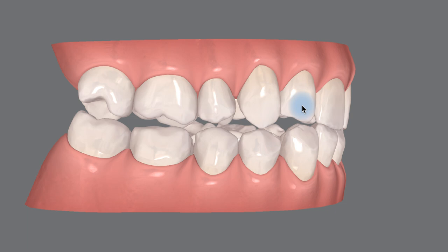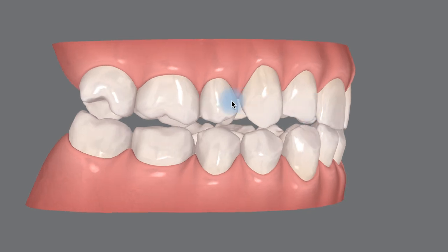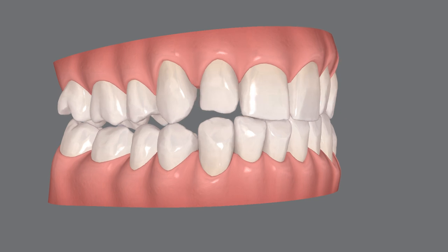And I think you had said that was less than favorable, or you made a comment to some extent on that not being the ideal outcome. And that's neither here nor there. That's historical. All we're going to do here is try to present you with an option moving forward. Because you're missing that, and I don't necessarily think you had the skeletal structure to warrant that kind of removal. If anything, removing a lower, because your skeletal structure is almost class 3 based on this image right here. So again, I'm a little perplexed on why they did that. With that said, what's in the past is in the past. But because of that, in order to solve this, we almost have to do something like this.